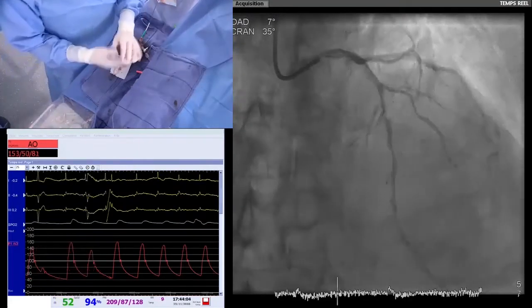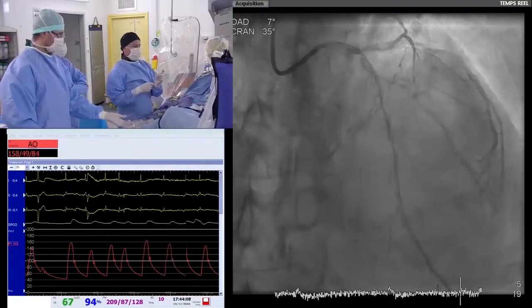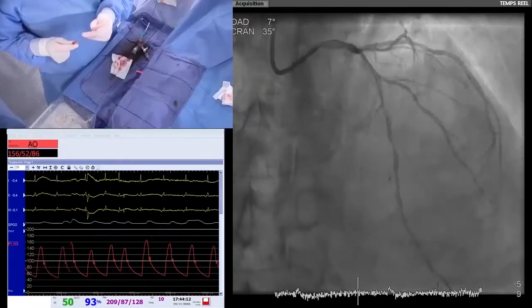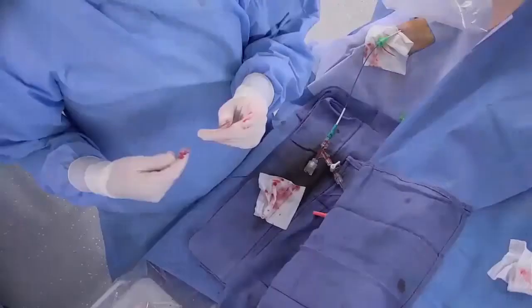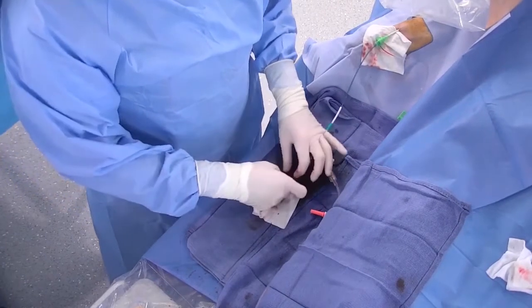Then, as Nicolas said, we should try to modify also the left main. We need to discuss whether to stent the LAD first and then proceed to the dilatation of the left main, or complete the dilatation all the way through and then start stenting. It's something we can discuss together.